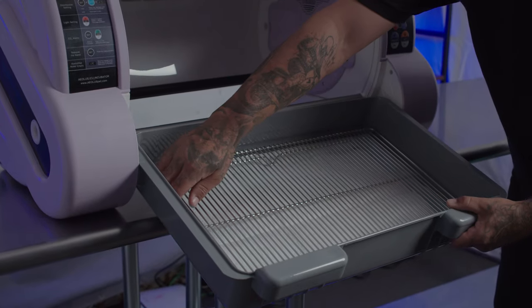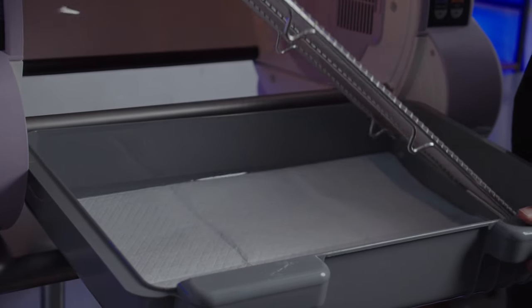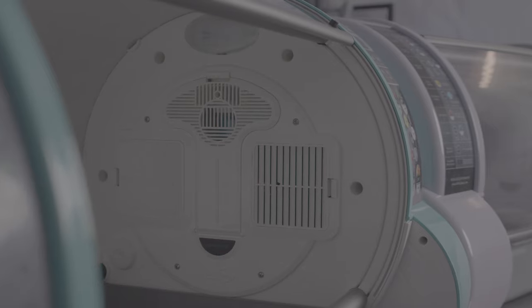Included standard on all Aeolus ICUs is the stainless steel elevated grate system. Simply place a puppy pad underneath and replace the grate system on top. Also standard on all Aeolus ICUs is a CO2 alarm. This ensures that unsafe levels of CO2 are never reached inside of your incubator.